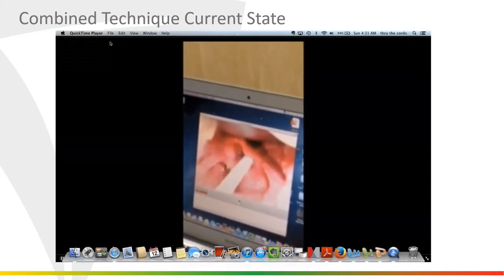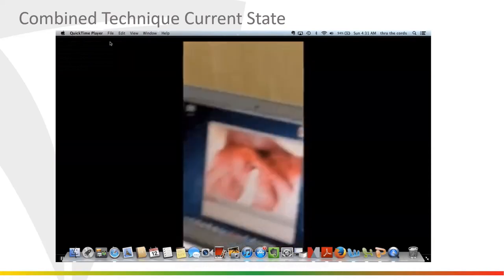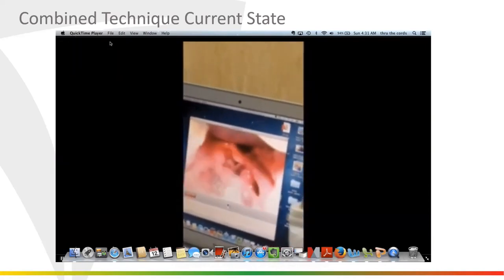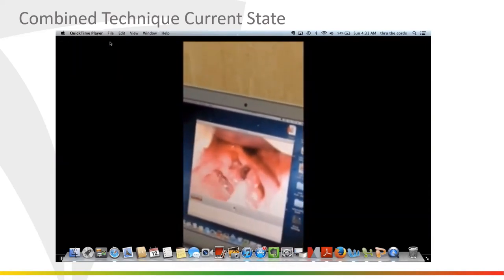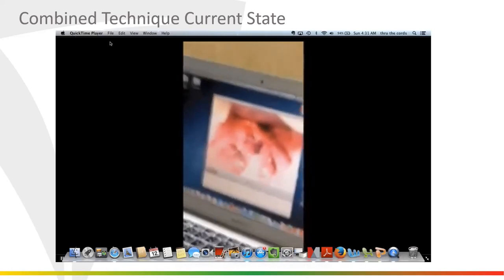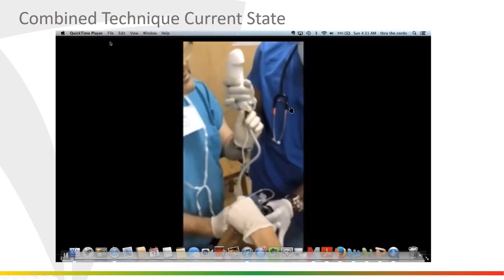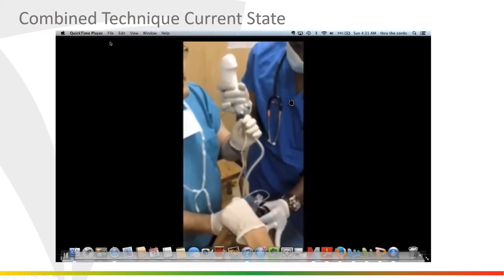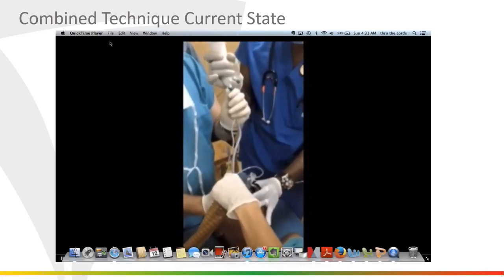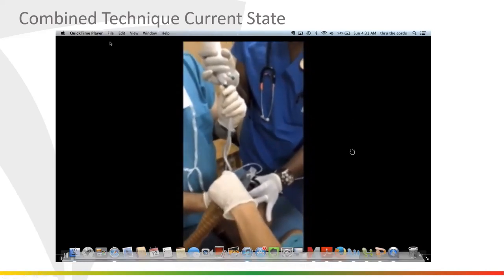You can delicately maneuver it where you want. And when you need to turn that second corner, you put the tip down and in you go. Then you can watch the tube go through the vocal cords, so if there are any hangups, you can correct them immediately. So all of these things mean that it's a 1, 2, 3. This is Dr. Christian. He saw this one and he performed the next one, and this is the way he intubates all of the ameloblastoma patients. So it's a 1, 2, 3 learning curve.